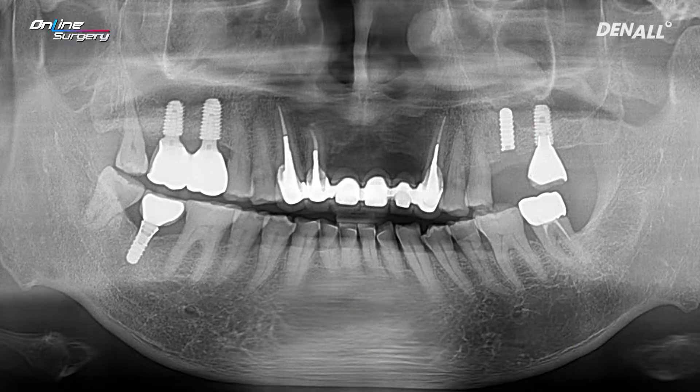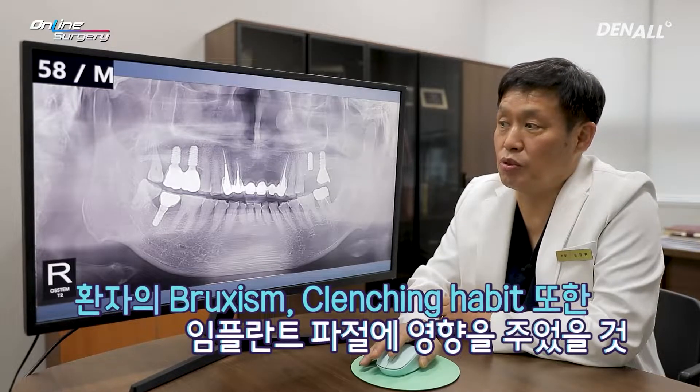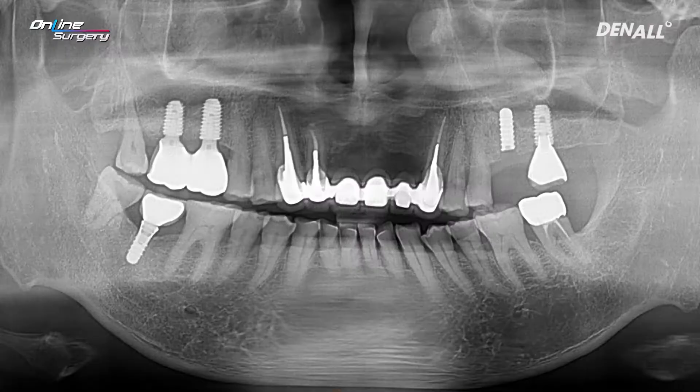It's not really common for implants from S to fracture, but the patient does have the habit of clenching and grinding. I realized that even if it is an implant from S, if the diameter is 4.1, it can fracture. The tissue level implant was fractured as shown.